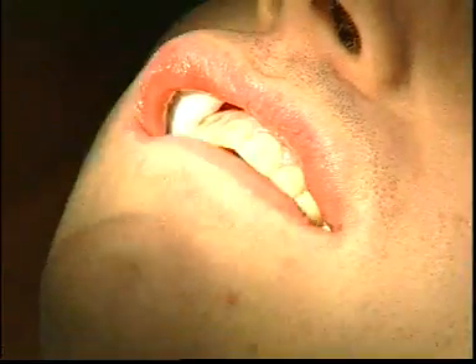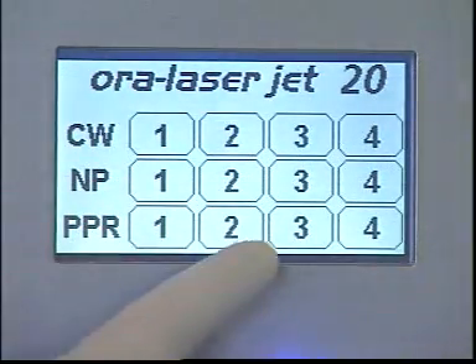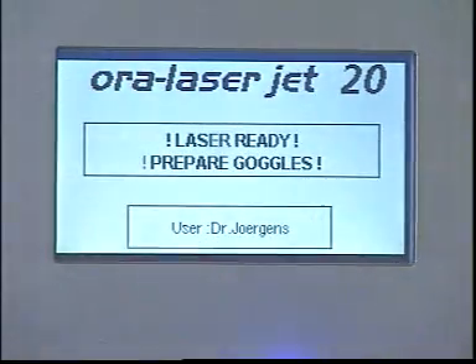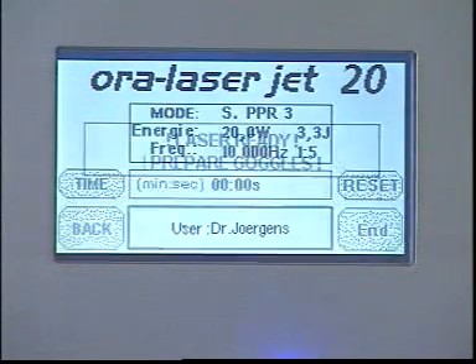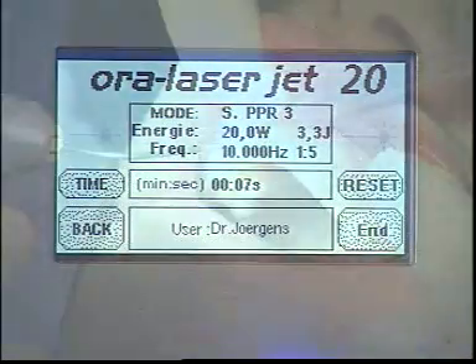In this patient we are carrying out laser treatment of periodontal disease in the region of the upper incisors. The Aura LaserJet is set to the S program. An essential precondition is prior removal of the supra and subgingival deposits by means of fine ultrasound systems.